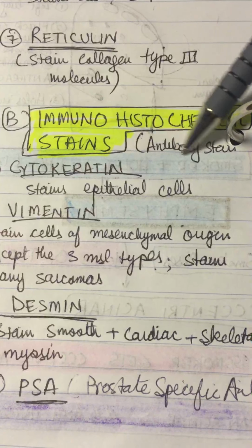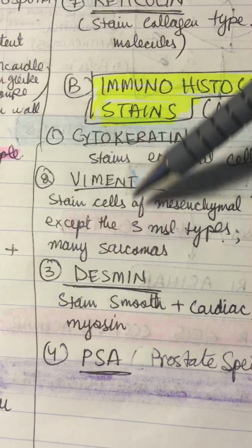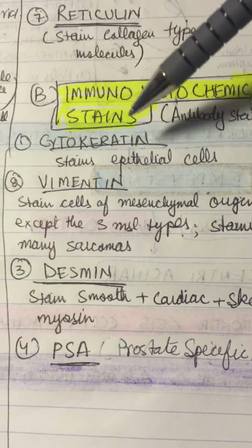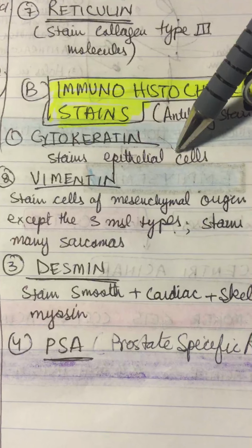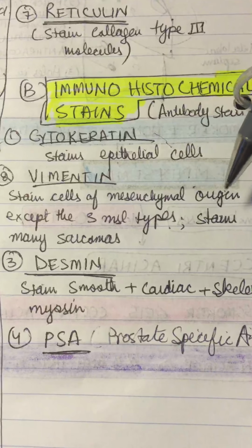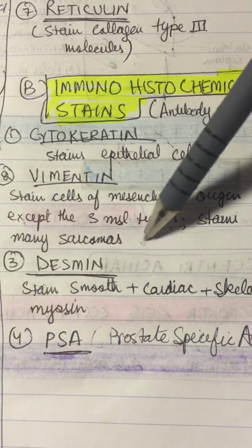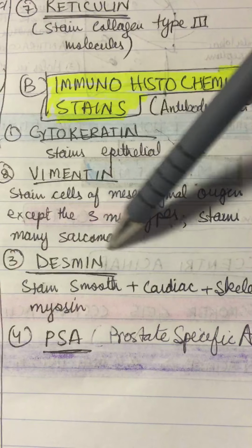These are basically antibody stains, and there are four main types of stains that we use in this category. One is cytokeratin, that we use to stain epithelial cells. The other is vimentin, that stains cells of mesenchymal origin except the three muscle types, and this stains many sarcomas.